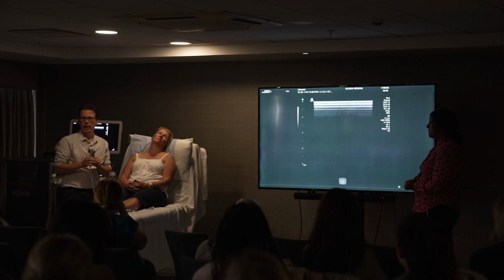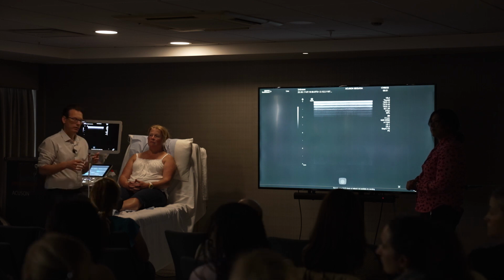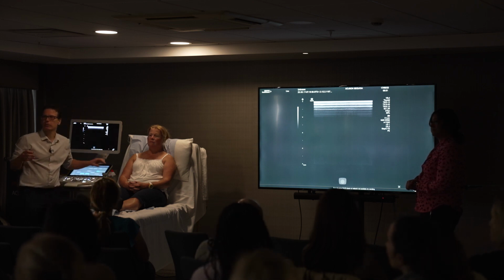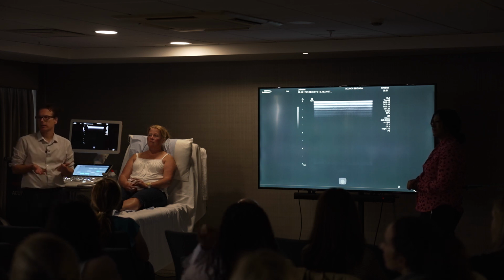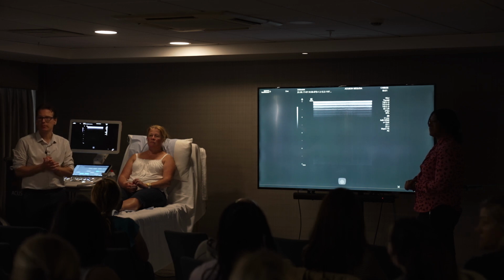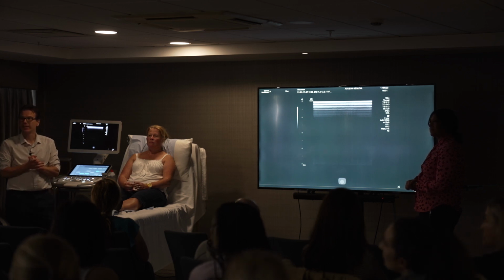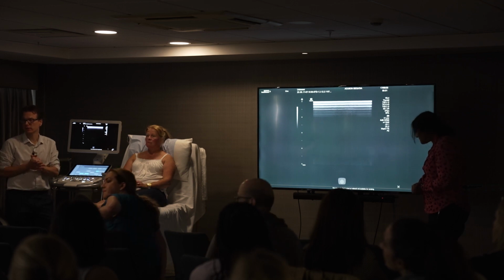Okay. Any questions about the sweeps or anything? Does everyone follow the same plan? So as head and neck radiologists, this is what we do in our practice. Do you have to have a chaperone when you do it? So we have a helper in all our rooms, yeah. So they act as a chaperone.